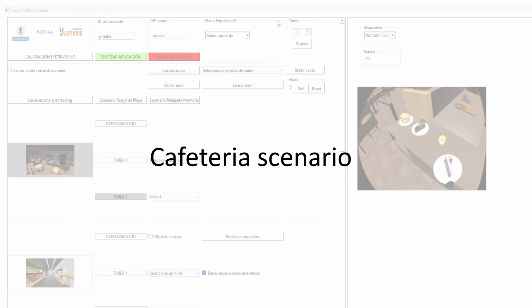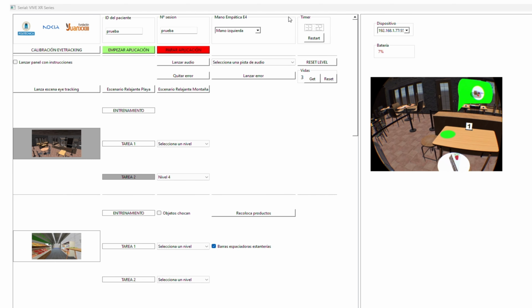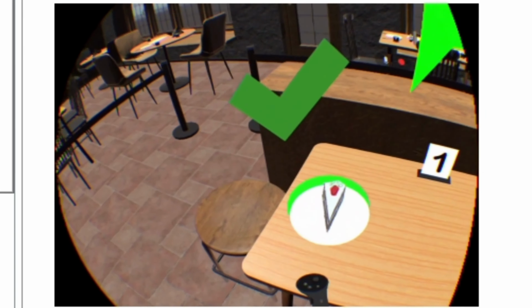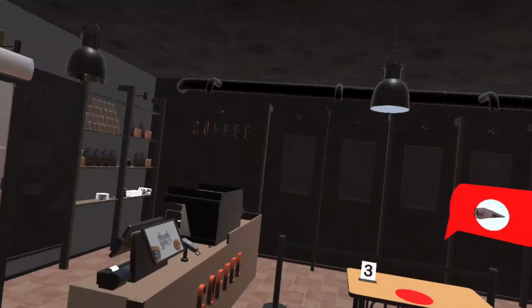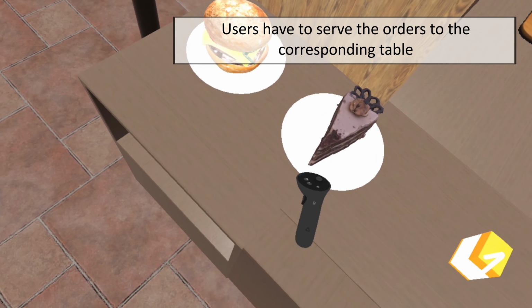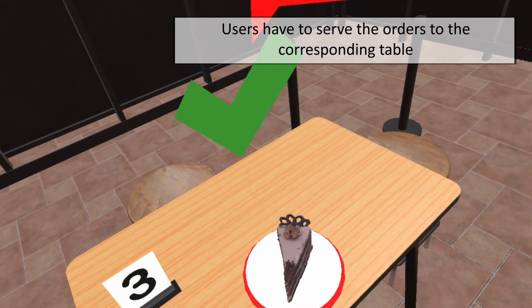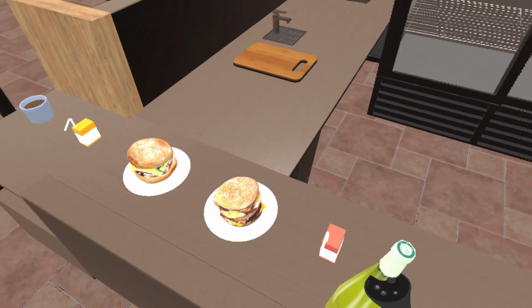Now we will see a demo of the cafeteria scenario. As well as in the supermarket, the scenario and level can be chosen from the interface. Here, the user is performing the second task, which is to serve orders to tables. When the level advances, more products and more similarity between products are involved.